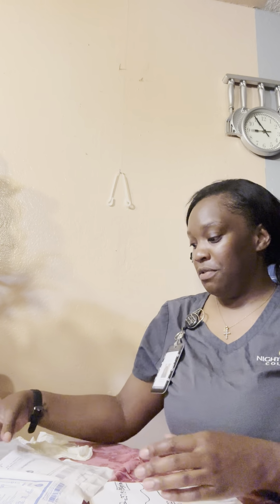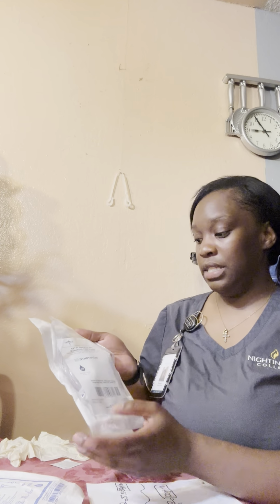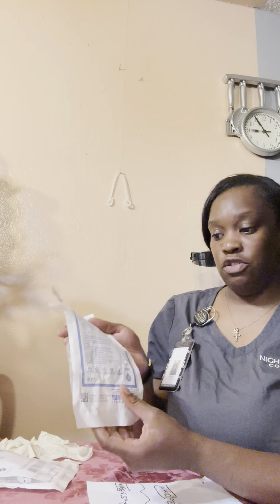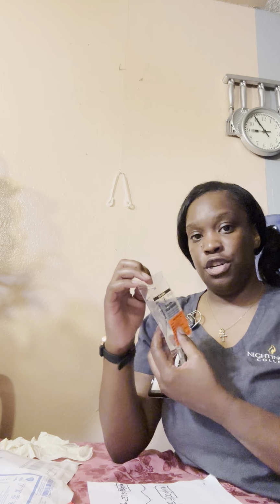So we have both of our tubing sets. This is the primary tubing. It's at 15 drops, and then we have our secondary set, and this is at 15 drops as well. We have our normal saline, and then we also have amoxicillin that the doctor has ordered.